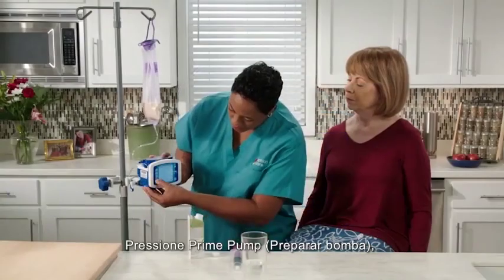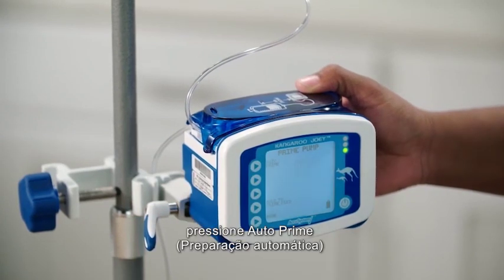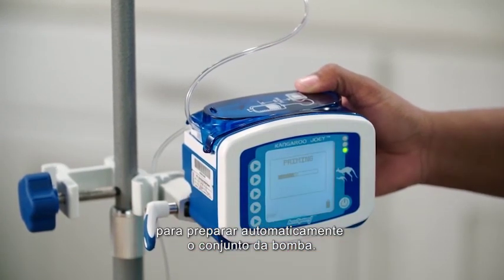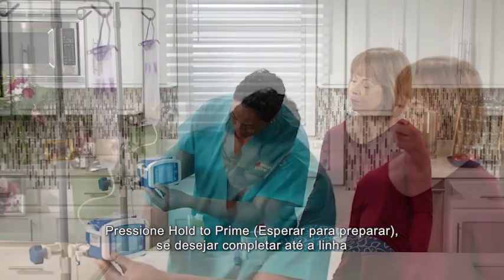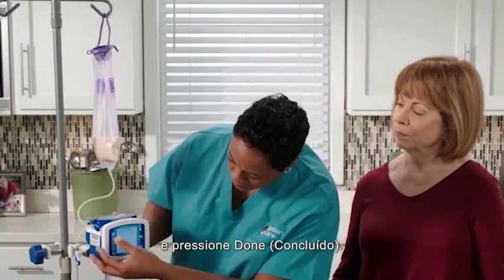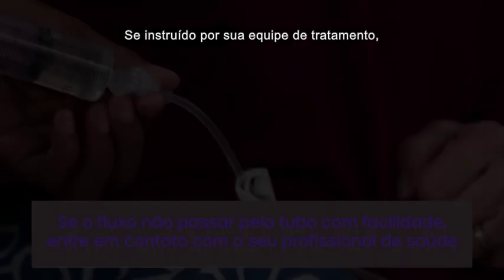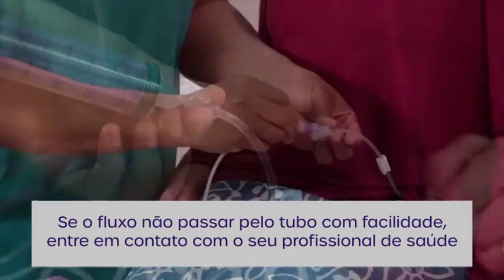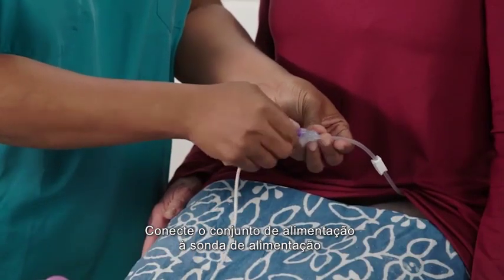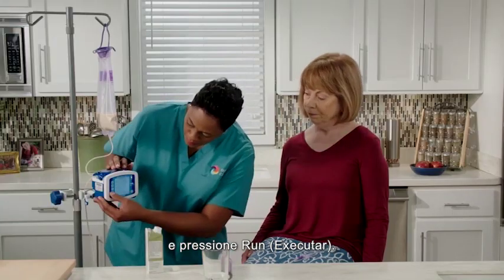Press 'prime pump.' Press 'auto prime' to automatically prime the pump set. Press 'hold to prime' if you wish to top off the line, then press 'done.' If instructed by your treatment team, flush your tube with water as directed. Connect the feeding set to your feeding tube. Press 'run.'